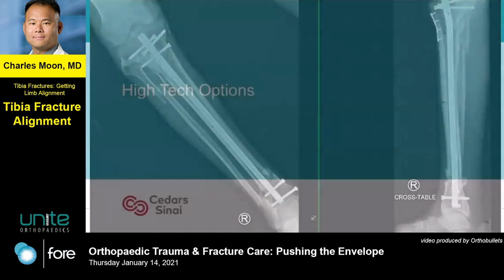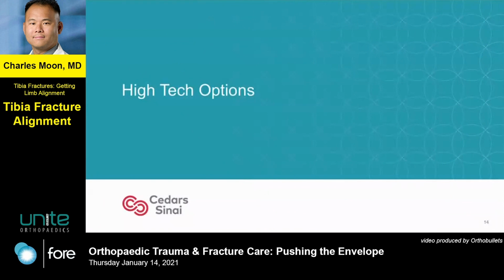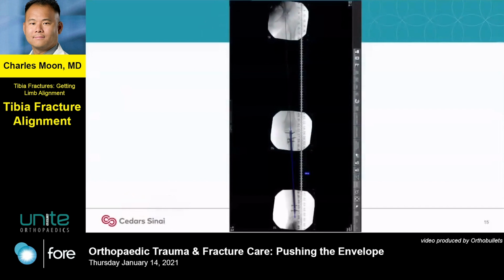comparing. I don't know what that is. So moving on, were there other high-tech options, since we're pushing the envelope and looking at other things? We've kind of pirated some of the arthroplasty software, and mostly we've been using this for osteotomies and cases like that, but it can be useful in acute trauma if you really are at a loss and not sure about where you need to be in terms of your alignment.